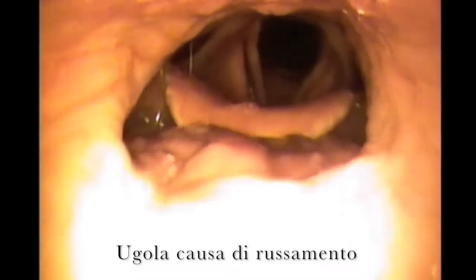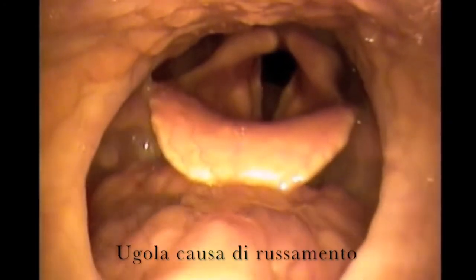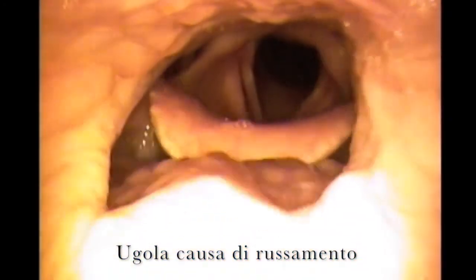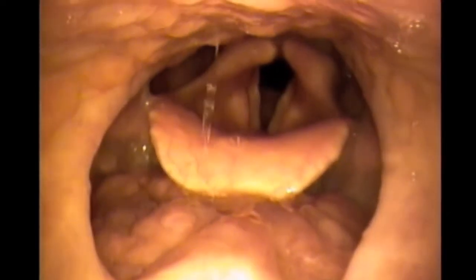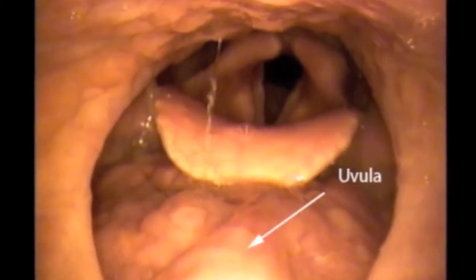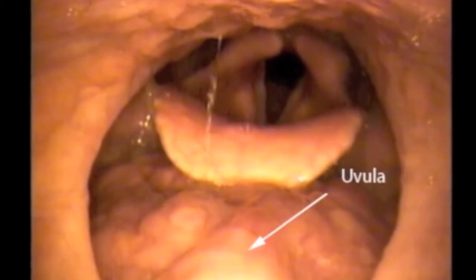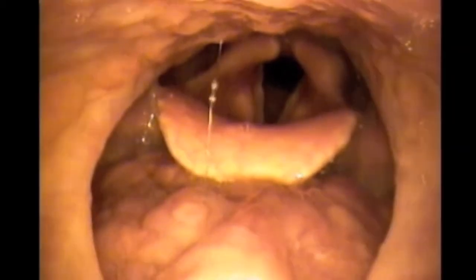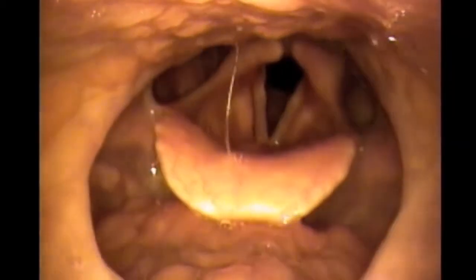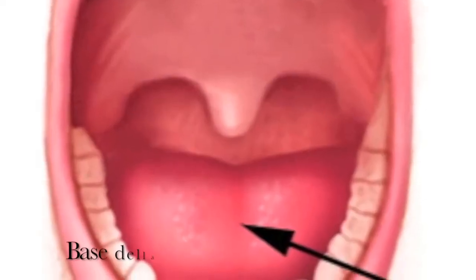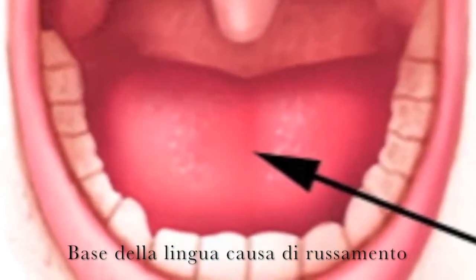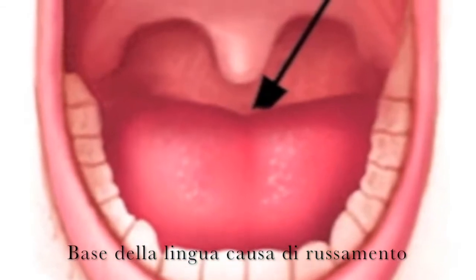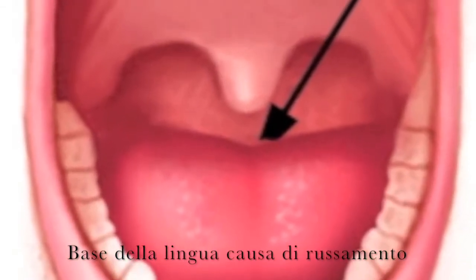Here is what a vibrating uvula causing a snore looks like from the inside. Beyond the uvula, the tongue itself or even the back of the tongue can also vibrate causing a snore.